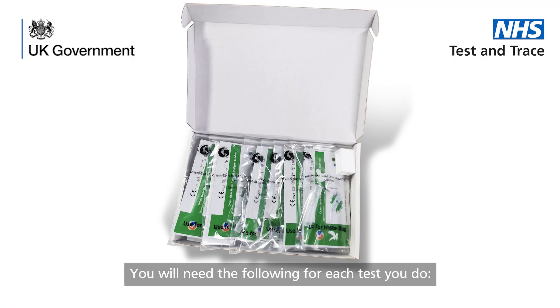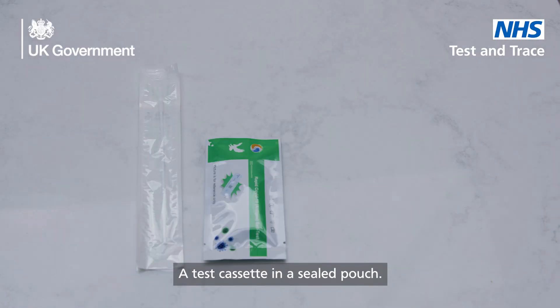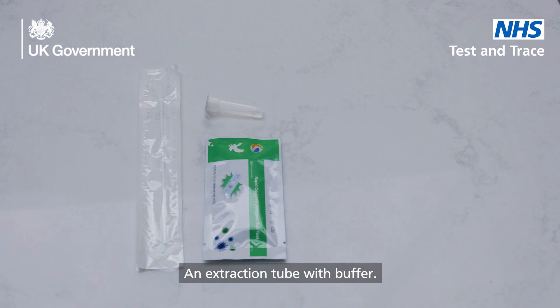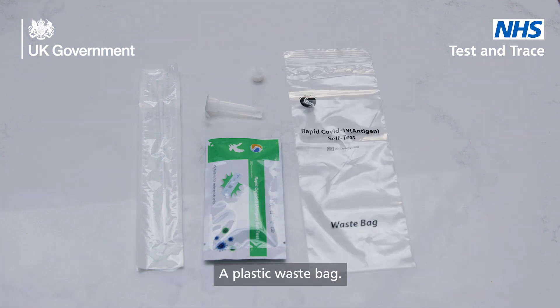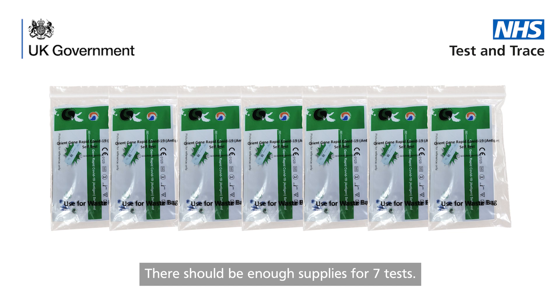Run one test at a time. You will need the following for each test you do: a sterile swab inside a sealed wrapper, a test cassette in a sealed pouch, an extraction tube with buffer, a nozzle cap, a plastic waste bag, and an extraction tube holder. These are reusable so do not discard. There should be enough supplies for seven tests.